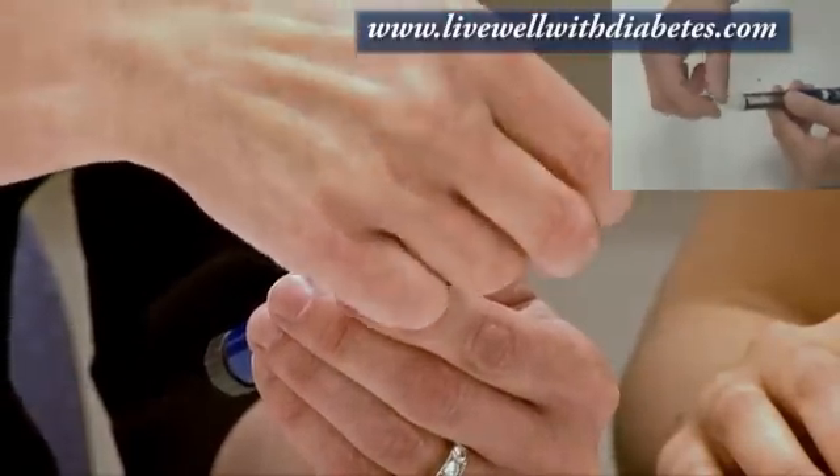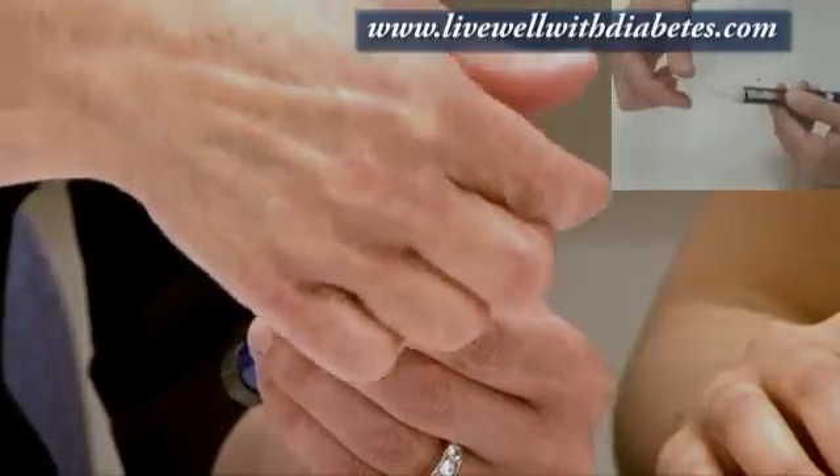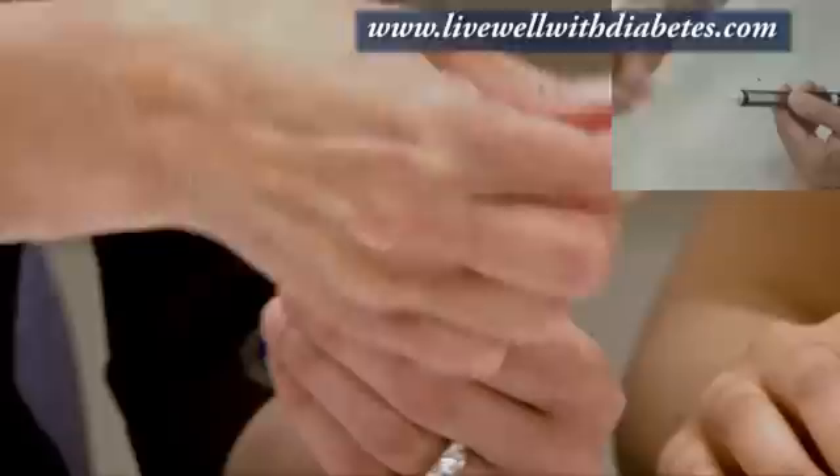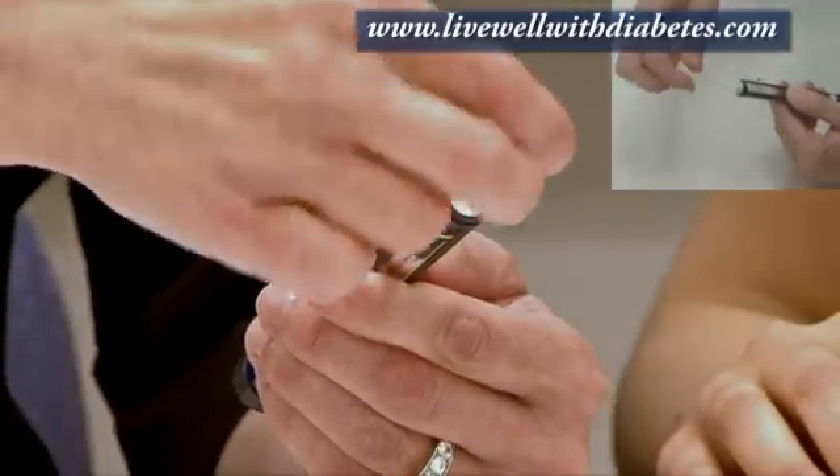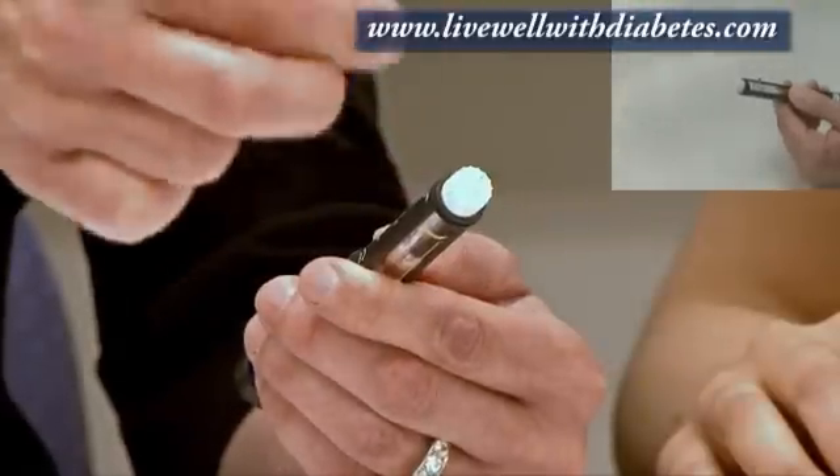Each pen needle has two caps on it. To take the caps off, always hold on to the end and pull the outer cap off — that's the outside cap. Then it has an inside cap right here; hold on to the tip and pull that one off.